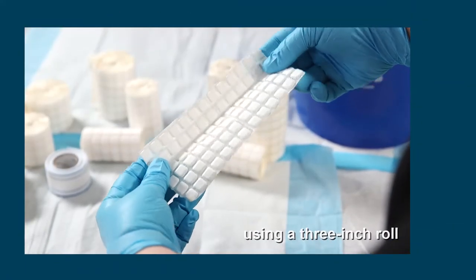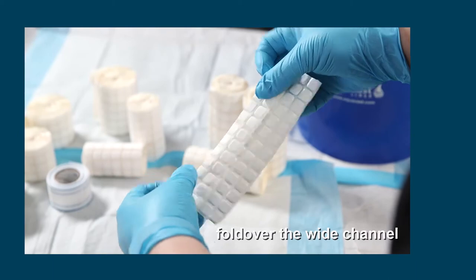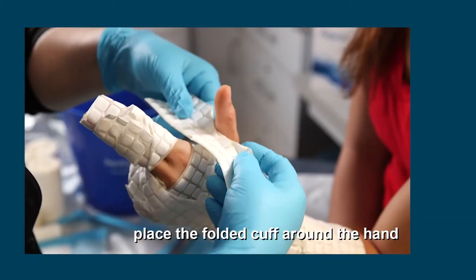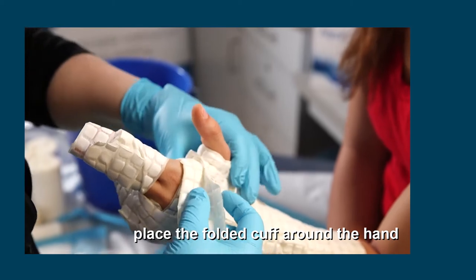Using a three inch roll, fold over the wide channel. Place the folded cuff around the hand.